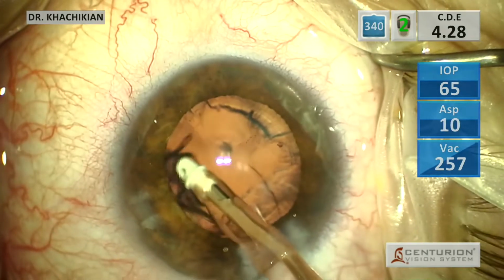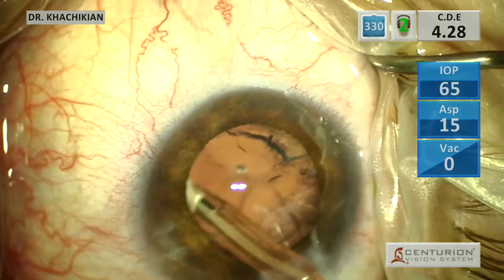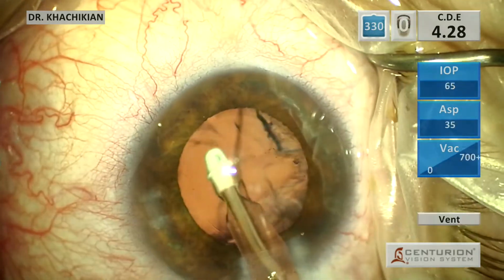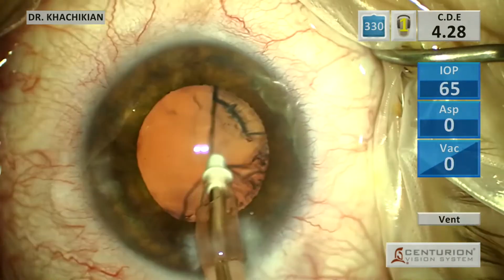I don't have a routine way of removing cortex. I kind of see what looks like it's going to come out easily, and I go that way. There you can see this piece didn't come out, so we move along to the next section, and lo and behold, the remainder of the cortex comes out on that side.